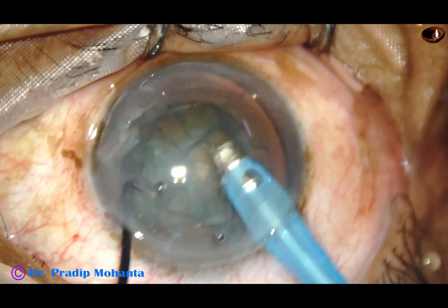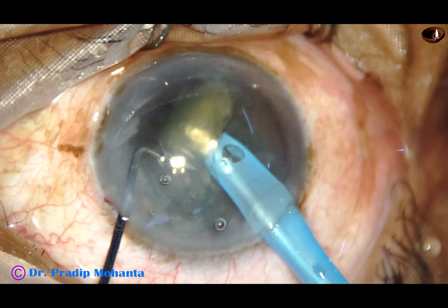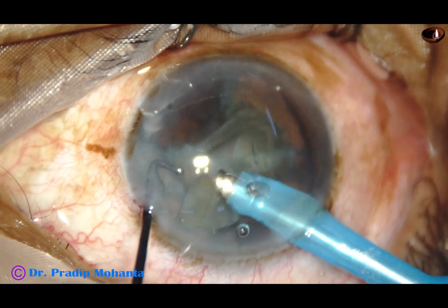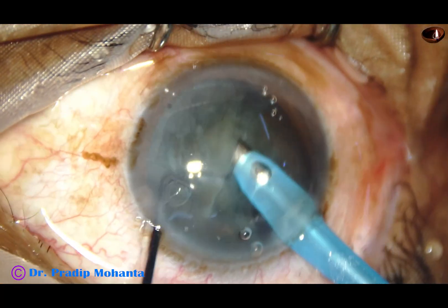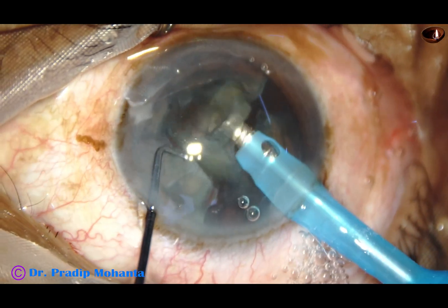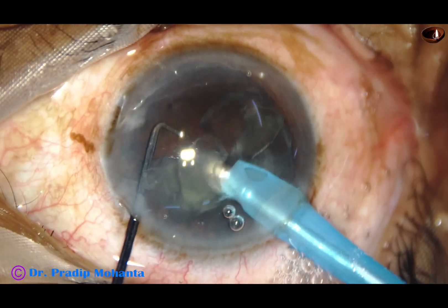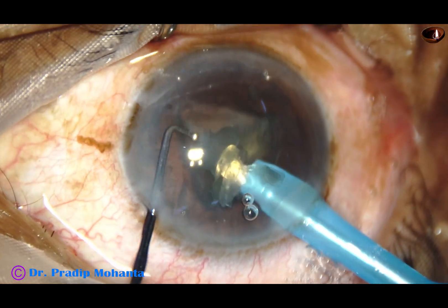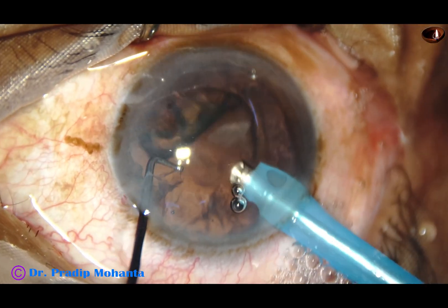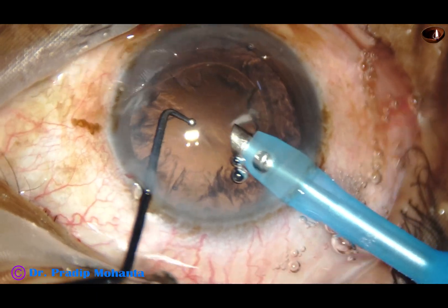And now see, this is again real time. Go and rotate the pieces — the pieces are free. They come to the tip easily. You don't have to go to the periphery and catch them. You don't have to do any dangerous movements. The pre-chopper movements are safe. The phacoemulsification of the pieces is safe. Actually, it is safer than any other technique — stop and chop or whatever you do in soft cataracts.